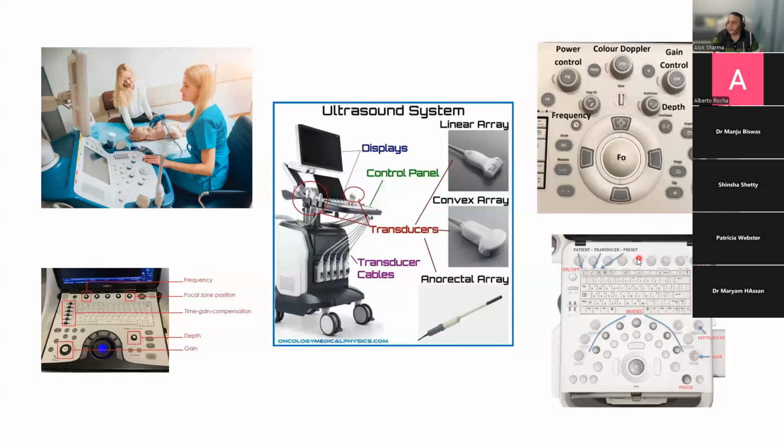Once we've done that, we then select our transducer. Here you can see a chest ultrasound being done with the linear transducer, but you can select a transducer by going to either a preset or by selecting the transducer and altering the frequency, depth, as well as the focus manually. And these, I would say, are the three most important buttons on your machine.